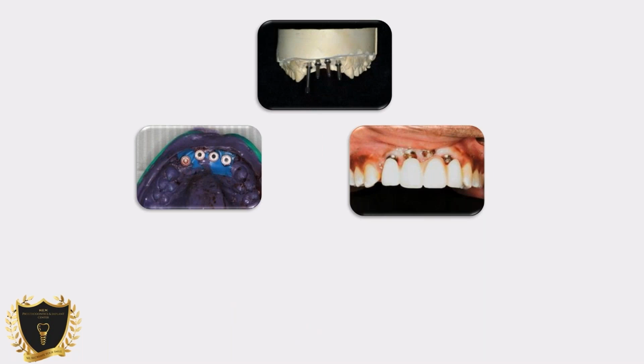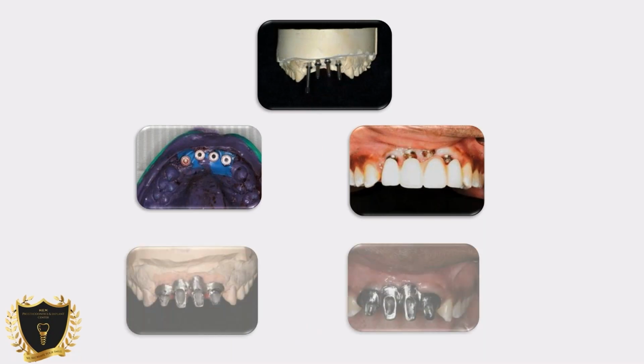Those days are gone when we said, okay, I found the bone here, let's put an implant in. It's not going to work. You cannot place implants at 45 degrees and expect the lab or restorative dentists to do miracles. So we have to plan prosthetically. We need to augment or graft the bone accordingly, develop the site, and go ahead and do the final outcome.